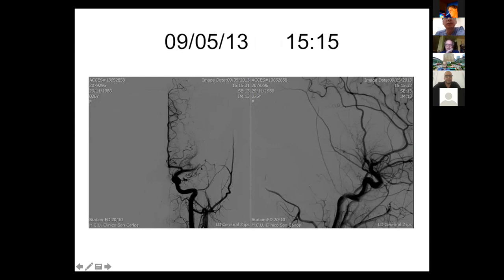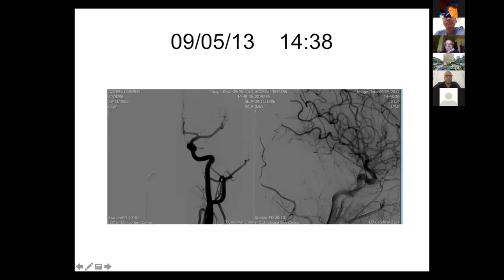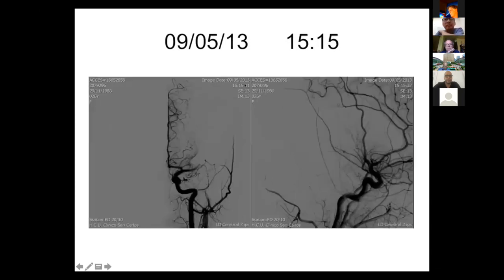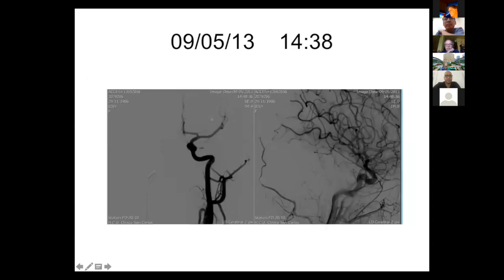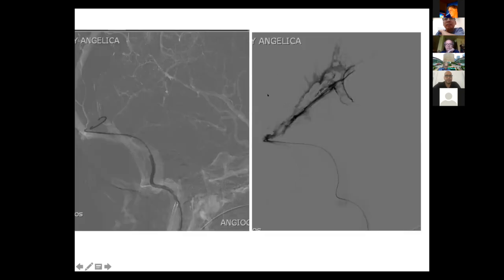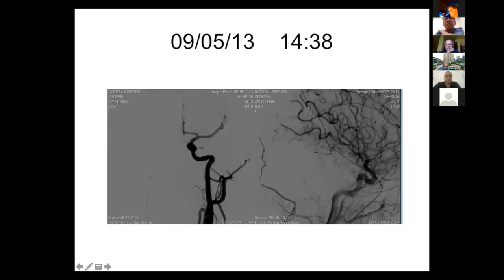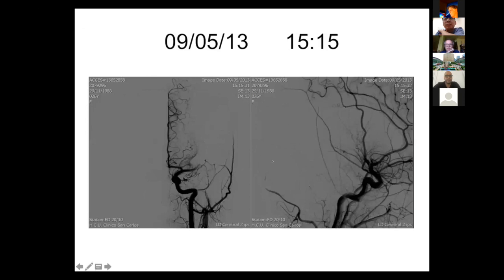At 45 minutes, there was spontaneous thrombosis of the middle cerebral artery. I decided not to treat this arterially — to not touch that territory and work only with the venous approach. This was a spontaneous, progressive thrombosis of the middle cerebral artery.